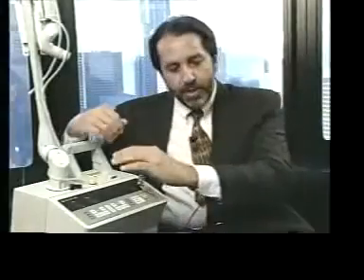So we can have a large area or a small area. We can focus right in on each individual wrinkle and take progressive layers of that skin off. So we can take a wrinkle that has a valley shape, reduce the mountains or the shoulders on the sides of the valley, and then go back and smooth the whole thing out with a second pass. Because it's so precise, we can control the amount of depth of penetration into the skin with the laser. Before, we had no way of doing that.